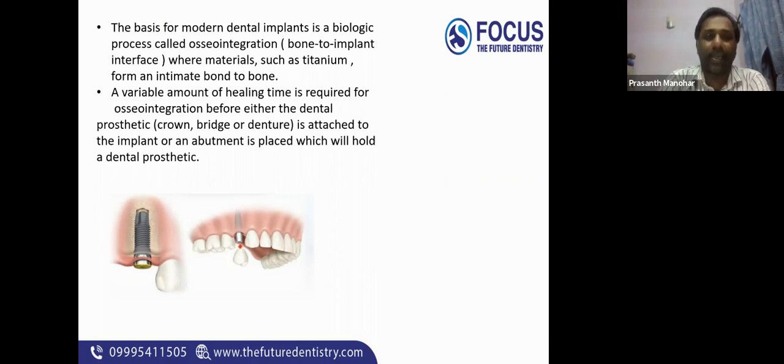Now, when this titanium comes in contact with the bone, it will have an intimate bonding between the implant and the bone. Understood? This process is known as osseointegration. Clear? This osseointegration is the reason for the success of dental implants.